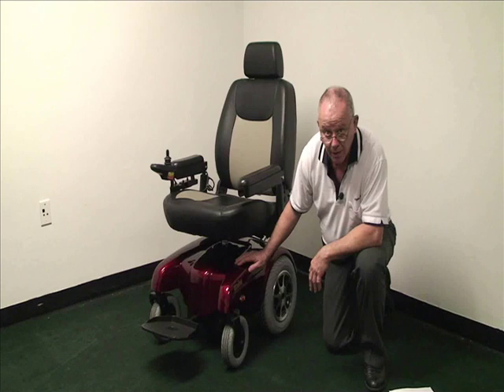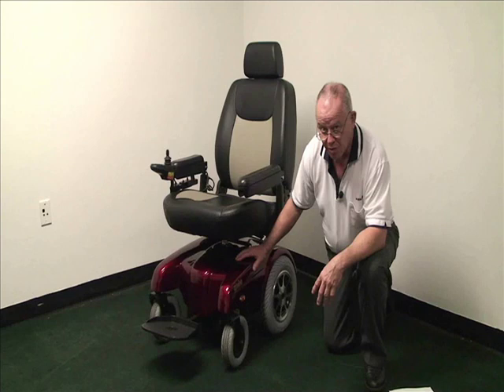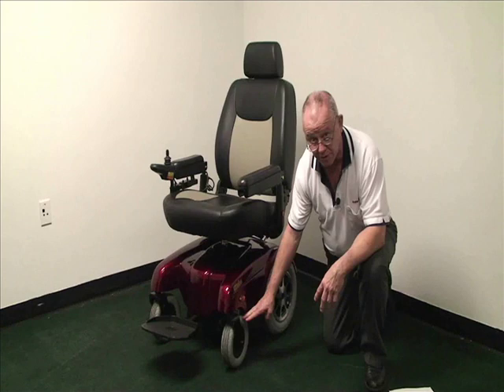The P301 is a Power-Based Rear-Wheel Drive Wheelchair. Rear-wheel drive meaning there's two sets of wheels: the 14-inch foam-filled drive tires and the 9-inch foam-filled casters.